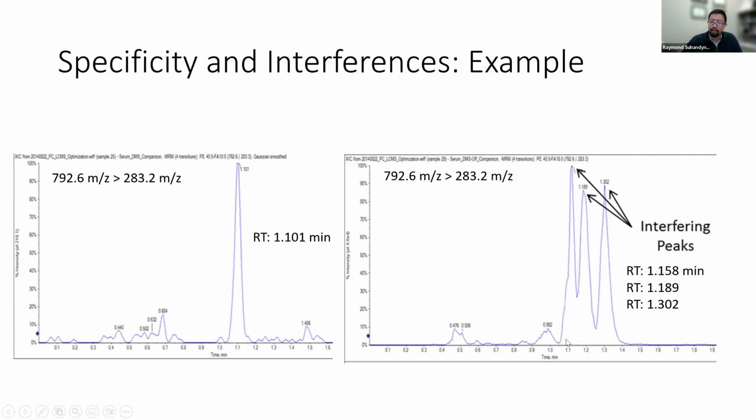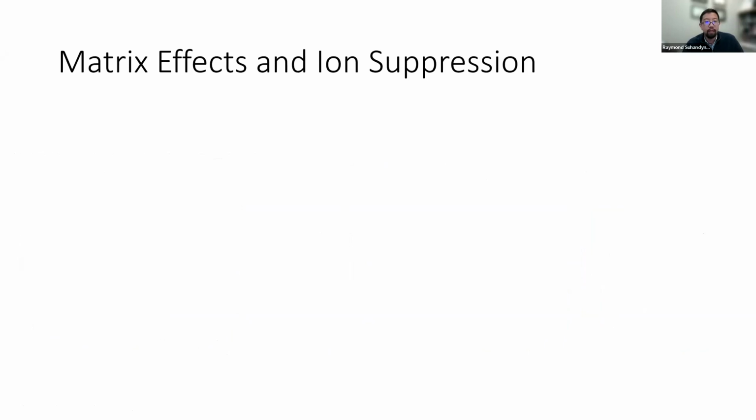So as an investigator, if you see really anomalous results, ask the lab to look back. We're all human, we make mistakes, but it's important to understand that the number's only as good as the sample, and also only as good as the method, and the validation that goes behind that method.